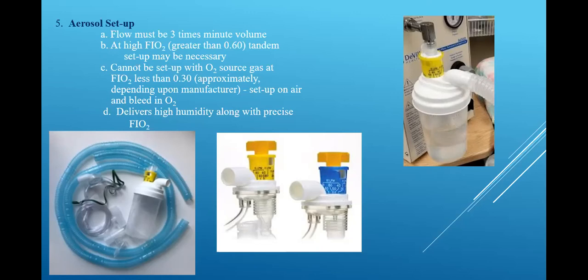But what's important is this. I want to show you something, all right? Let me show you what's involved. You have the large volume nebulizer. This right here is called a large volume nebulizer because it uses a lot of water, okay? And the top part is the Venturi entrainment part. You have one large bore tubing going to a water bag, and then another large bore tubing and then whatever your patient is on.